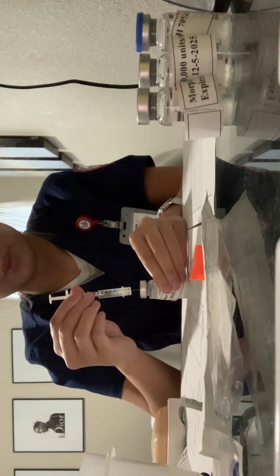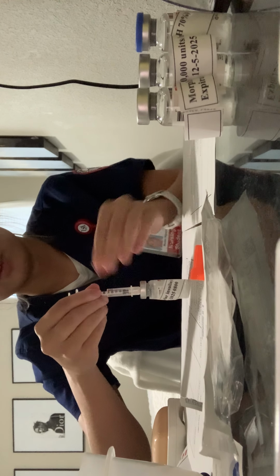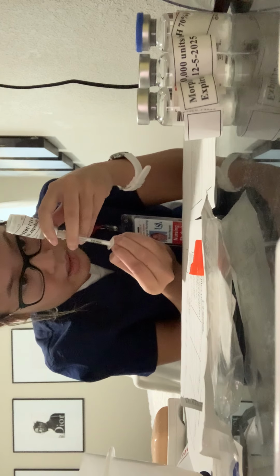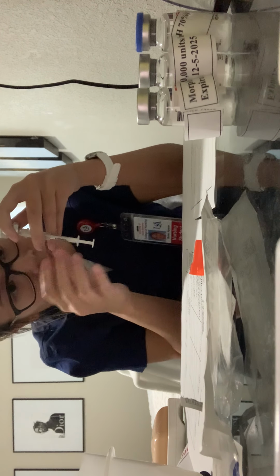And I'm going to put into the vial and inject the air into the vial. Turn it over, hold it steady, and I'm gonna draw out 10 units of insulin, making sure there's no air bubbles, and if there are, just give it a good flick.